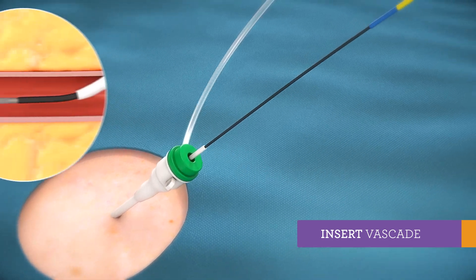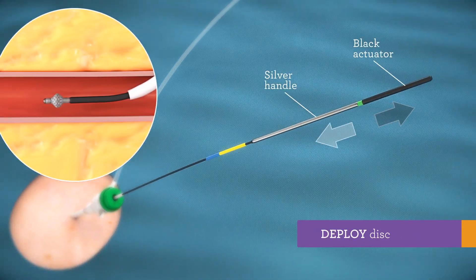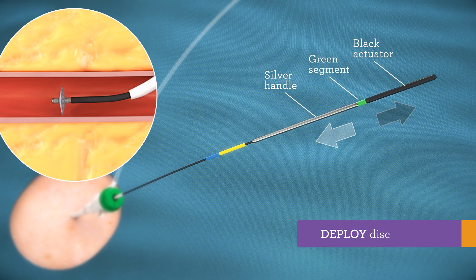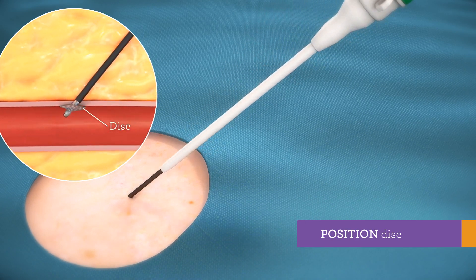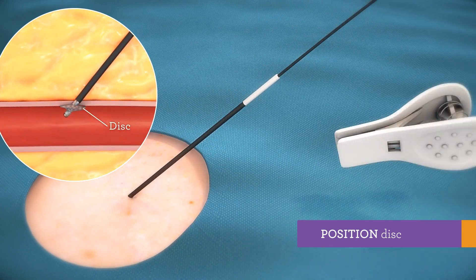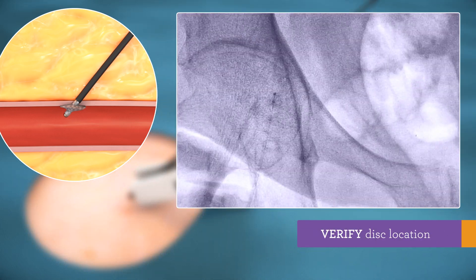To achieve temporary hemostasis, deploy disc by pulling apart black actuator and silver handle until you feel a detent and green segment stays exposed. Remove sheath and position disc against the vessel wall. Apply clip. Via fluoroscopy, verify disc is against the vessel wall.